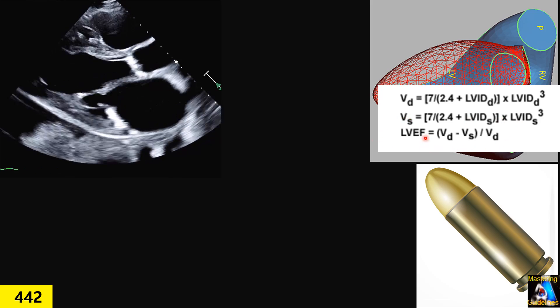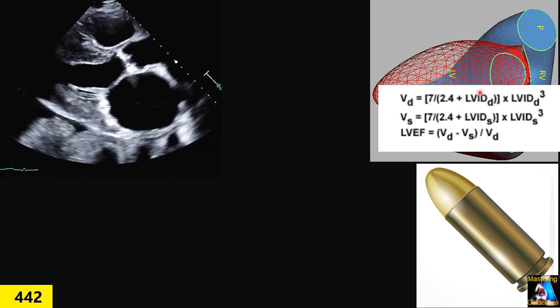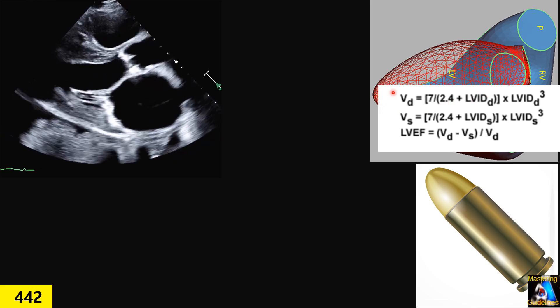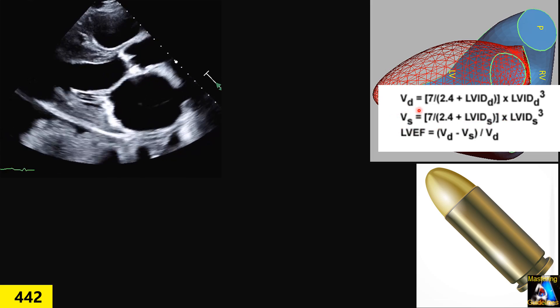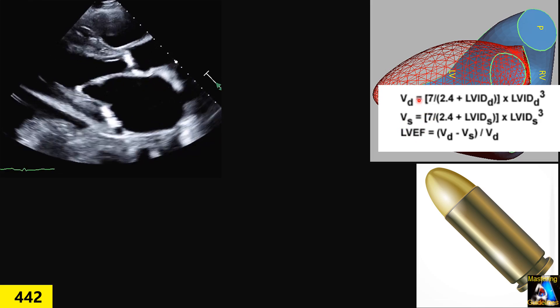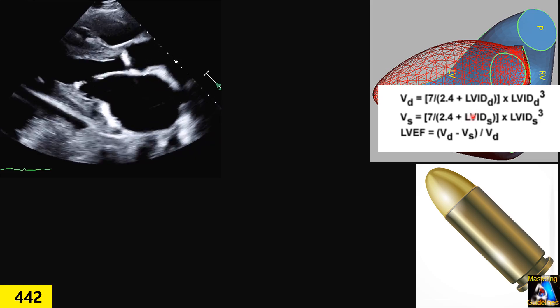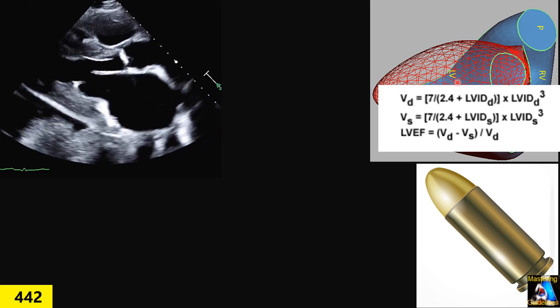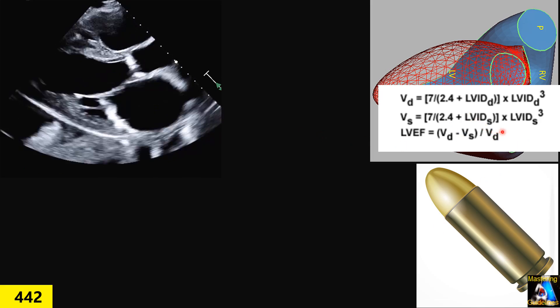We measure LVID at diastole and the machine calculates left ventricular volume at diastole. Then when we measure LVID at systole, it calculates the left ventricular volume at systole, and finally by formula it gives us the ejection fraction. This technique assumes the left ventricle is cone-shaped, or more accurately bullet-shaped. Only in that situation will this formula and technique be reliable.